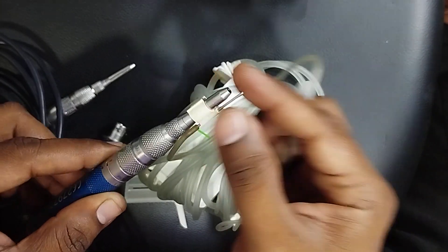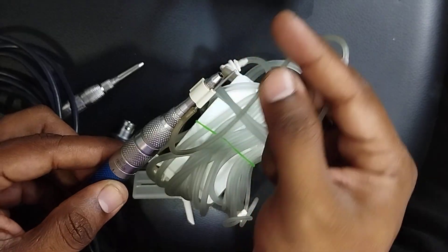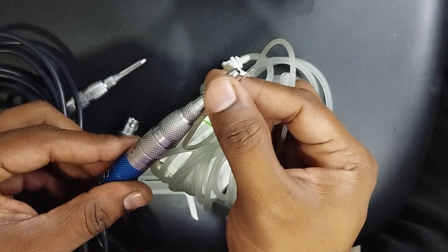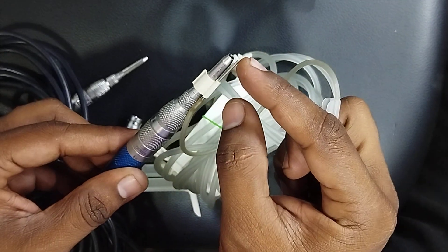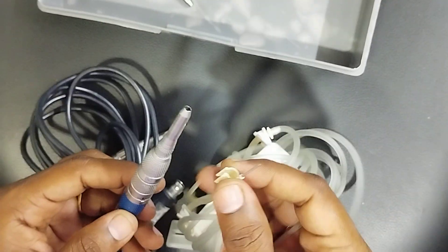You can adjust the tube position accordingly. For example, if you need deeper irrigation and the burr is longer, you can move it forward so the irrigation reaches the deeper edge. If the burr tip is short, you can move it back so that the irrigation is pointed at the appropriate position.